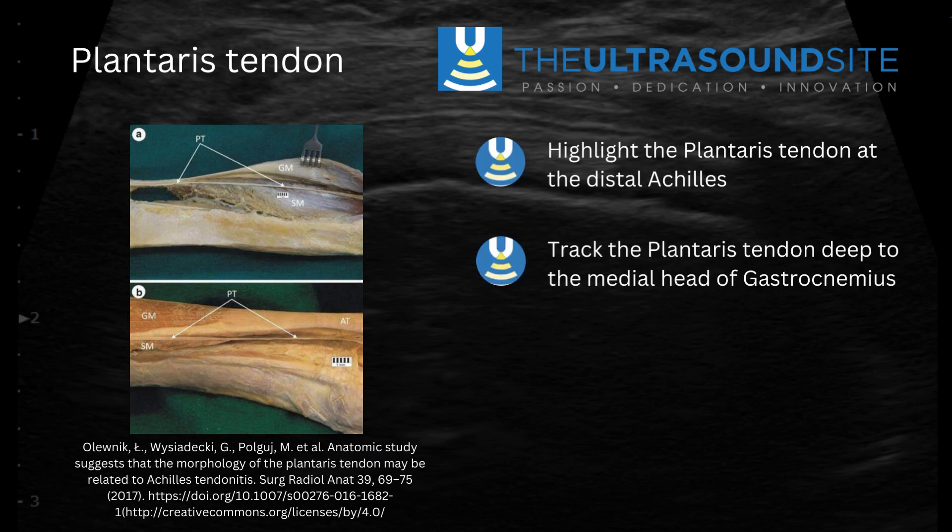Within this tutorial video we're going to have a look at the plantaris tendon and where this sits in the posterior aspect of the calf. We're going to focus upon tracking it from distal to proximal and how it sits on the medial aspect of the achilles tendon and then travels deep to the medial head of gastroc.